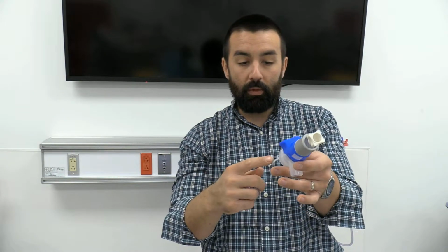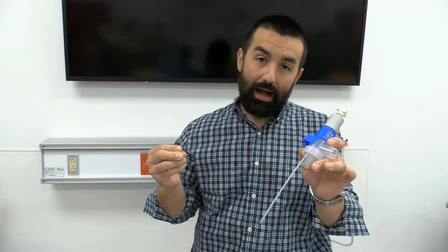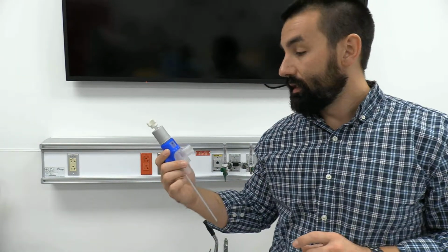The way that this works, it still goes through our little jet that's got a fixed diameter. Same thing happens with air entrainment, but with that lateral pressure drop, we have a little piece here that's able to draw some of that sterile water from the bottom of this bottle and inject it into this gas stream. As those water particles hit that gas stream, we get a shearing of these forces, and that's what suspends it in a gas, and we create an aerosol with these large volume nebulizers.